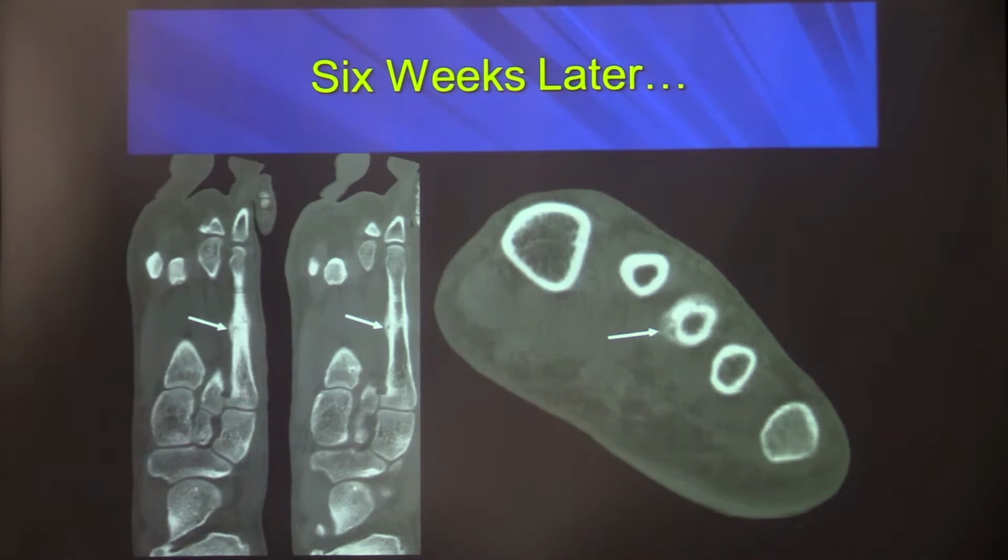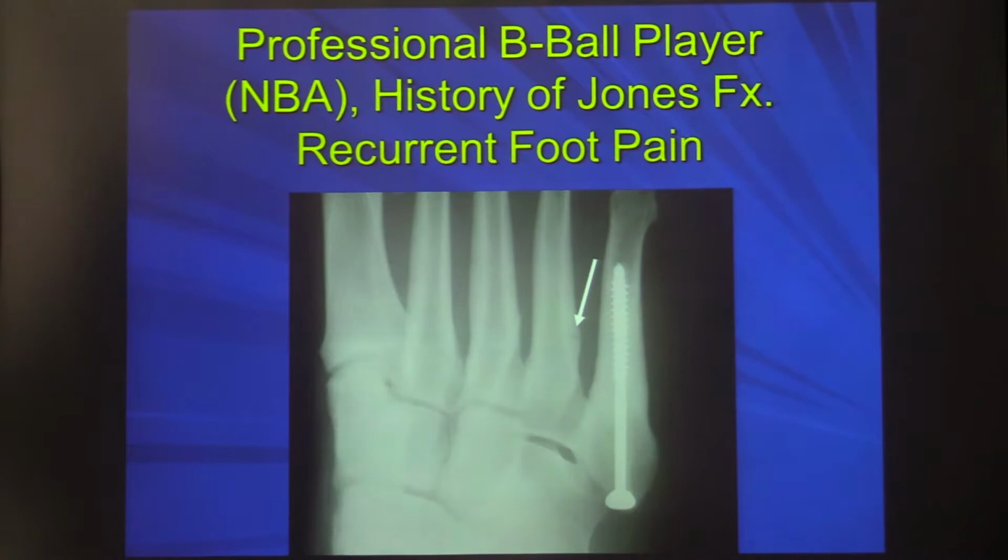Here's another former Celtic player who had a Jones fracture at the base of the fifth ray metatarsal, healing nicely following internal fixation with a screw, who presented with new foot pain.